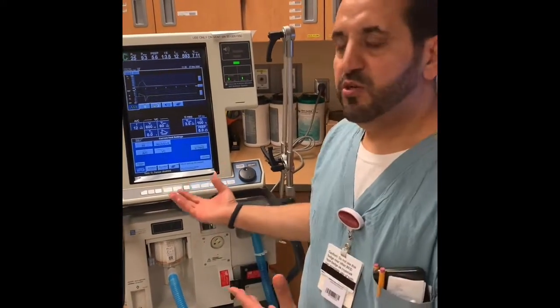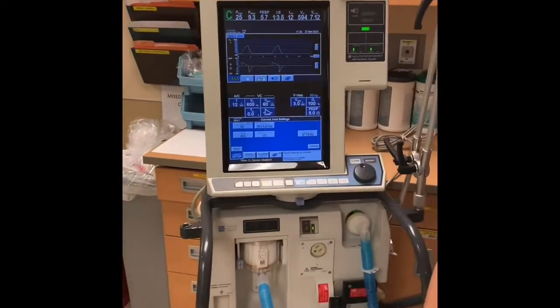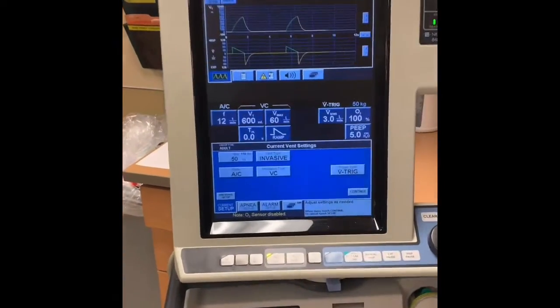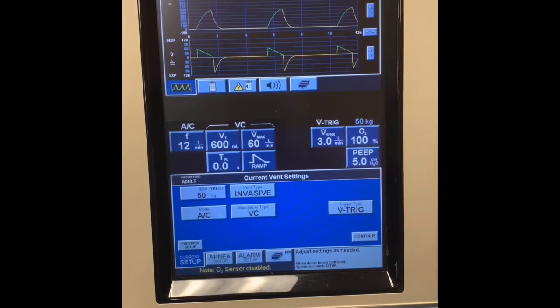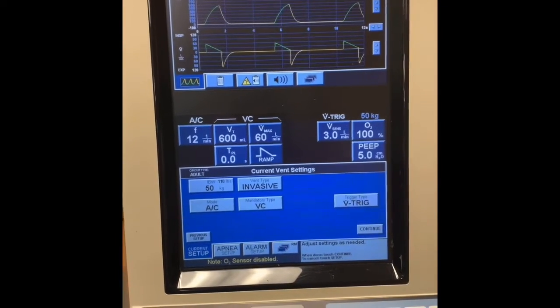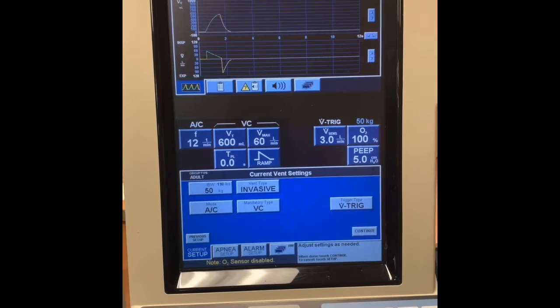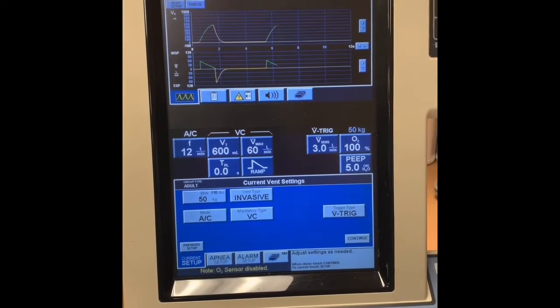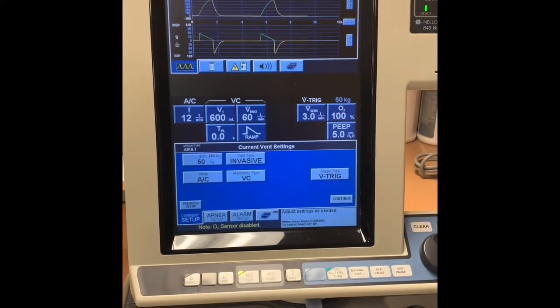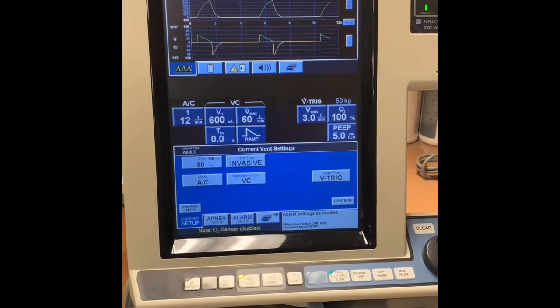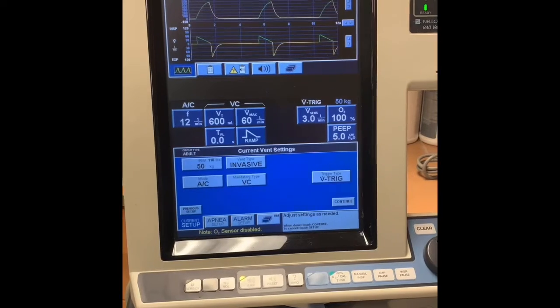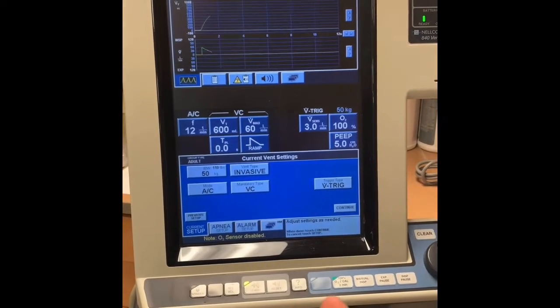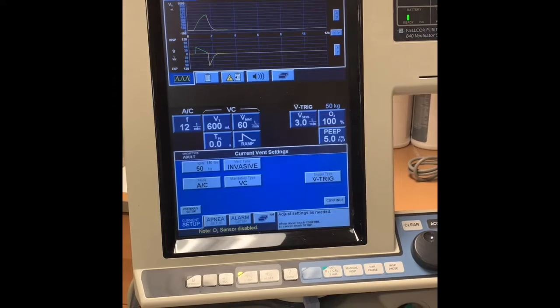The first thing you want to know is how to set it. Looking at this vent now, we're on ACVC: 12, 600, 100%, 5 PEEP. When you get to bi-level APRV, you're going to be on settings other than this. You might even be on pressure control with IE ratio 4 to 1. But we'll start here. You need to know where to start your high PEEP, your low PEEP, your rate, and FiO2.